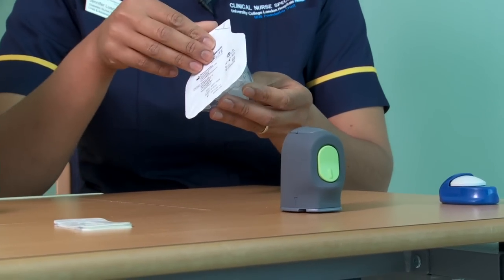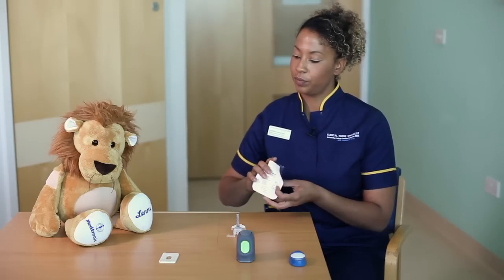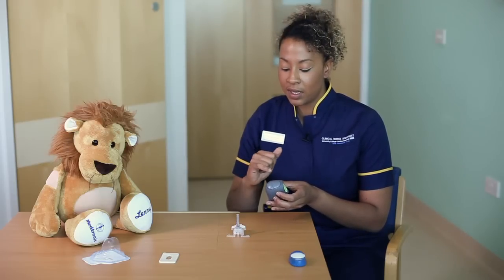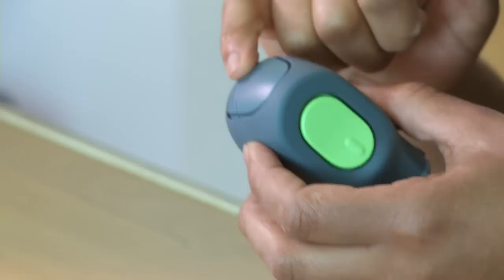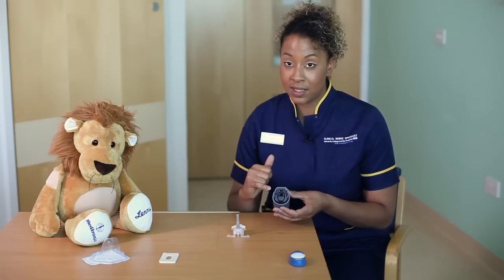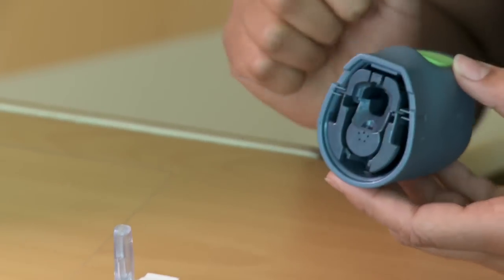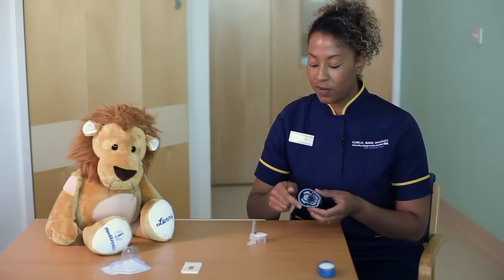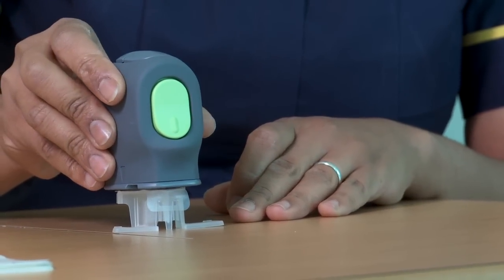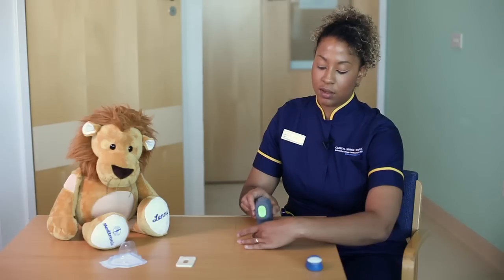Take the N-Lite sensor out of the packaging and place it on the table. Pick up your Inserter. It can be a little confusing because at the top there are things that look like buttons but aren't. What you're interested in is the green button on the front. On the inside of the Inserter there's a hole where the N-Lite sensor needs to go. Make sure the round part of the insertion device goes towards the round part of the sensor, then place it and click down. Hold the little feet on either side and pull the Inserter up.